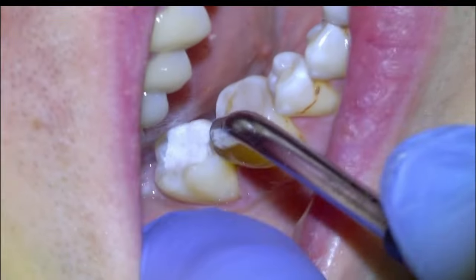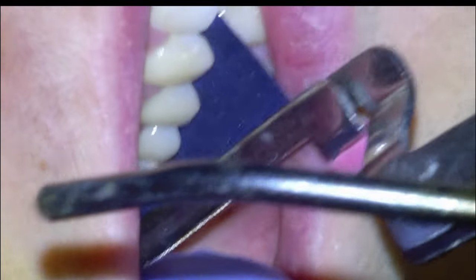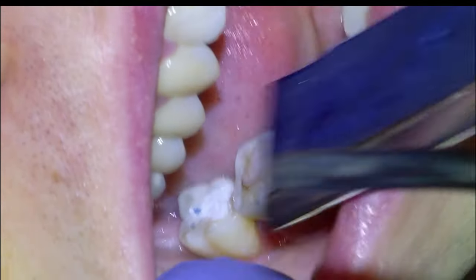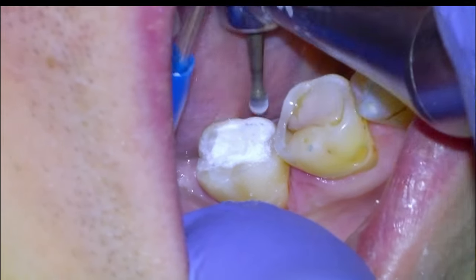And once we're happy with the shape, we'll dry the material and then check the bite with some thick articulating paper and take down any high spots with our large round on the slow speed.